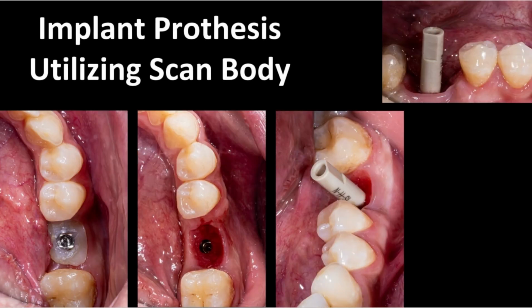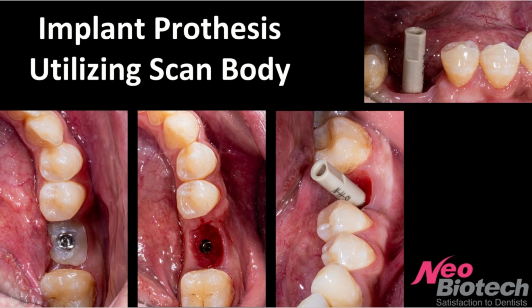Implant prosthetics utilizing the scan body is the indirect technique. For the indirect workflow, you select scan body scan. You will scan the emergence profile first, then in the second step, the scan body will be captured. The scan body will locate the fixture virtually at a high accuracy level. In my opinion, it is the most accurate and smooth workflow. The only reason that pushes you not to use a scan body is if your implant supplier doesn't offer it.